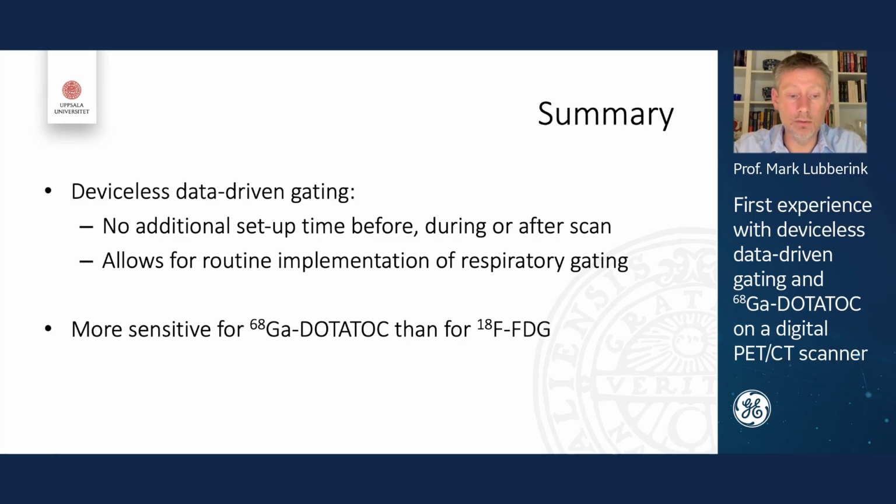And what we found in our work is that data-driven gating appears to be more sensitive for the respiratory gating signal for DOTATOC than it is for FDG.